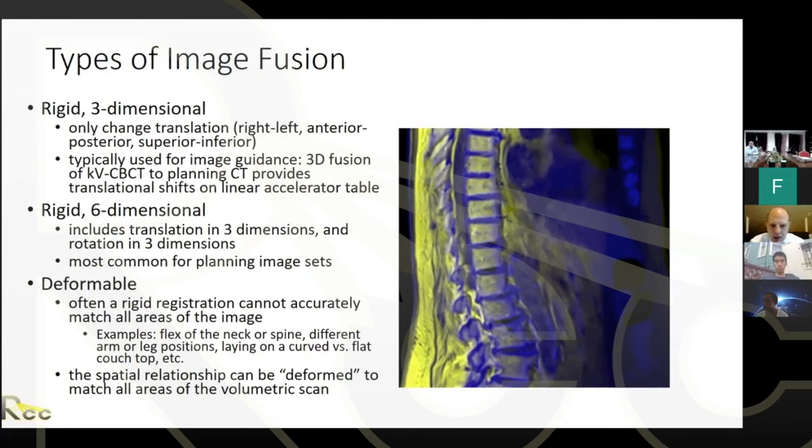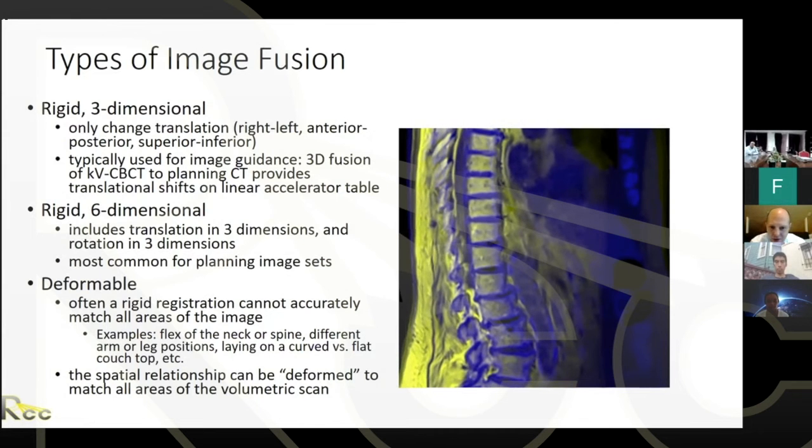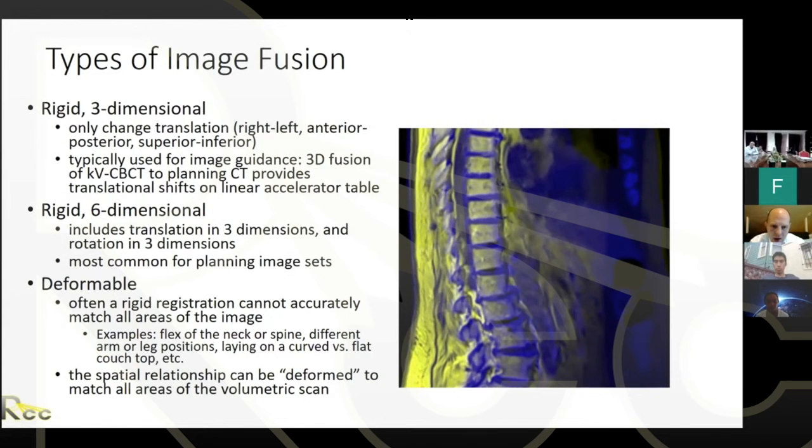So in those cases, and another good example is for a head and neck case, if the neck was different during the CT and a diagnostic scan, or if the patient was lying on a curved surface as opposed to a flat surface.